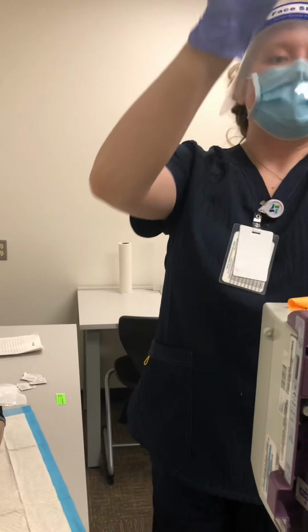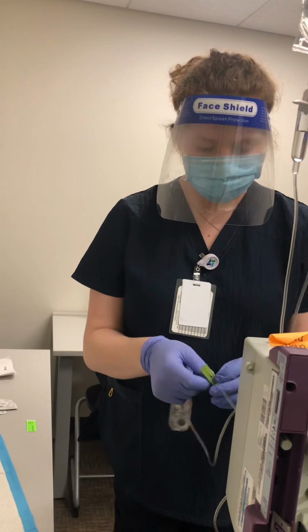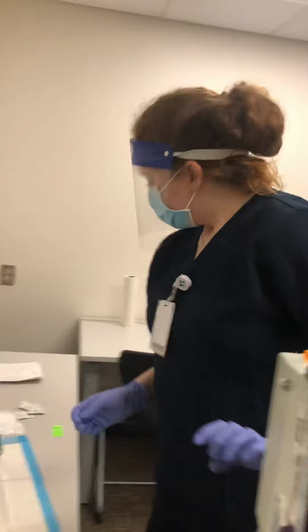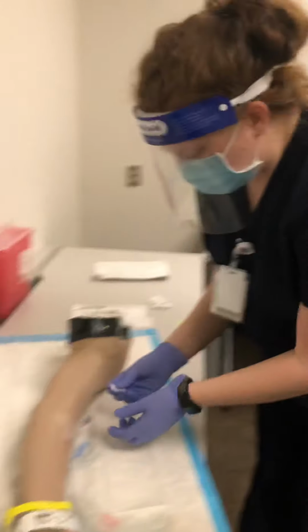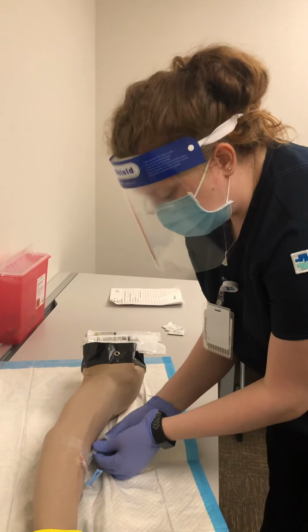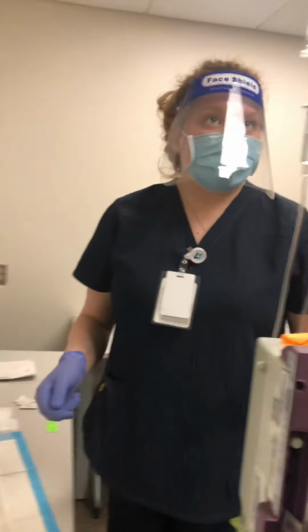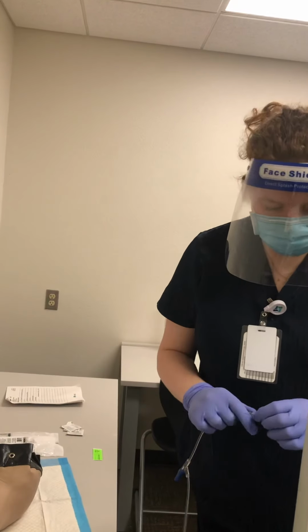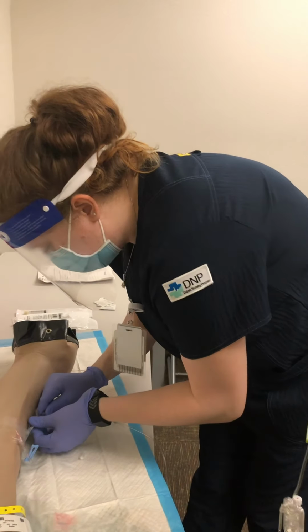So, go ahead, I just want to move that higher up. Okay, so Shirley, we are going to clean your port again. And if we hadn't given the medication and done several flushes and done the most previous flush, we would be aspirating and flushing again. But since we did that, we're not going to do that over again. So I have this. We are going to hook this up. Just clean it.